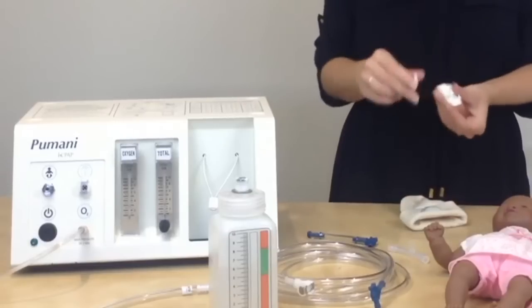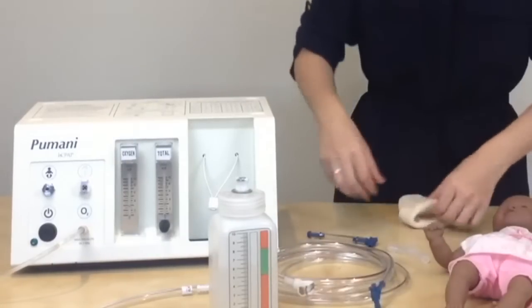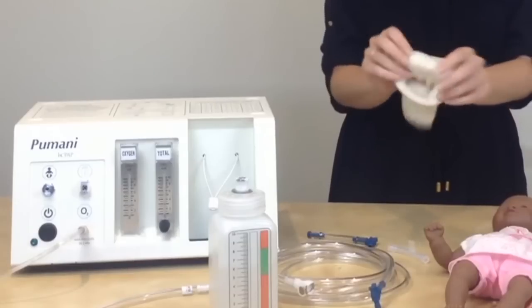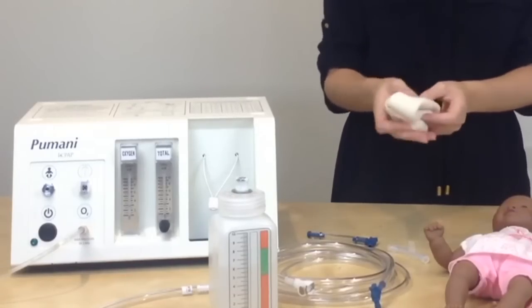The hat clips are designed to be reused, and you can clean and reuse them. The hats typically stretch out when they're on a baby, so you will need to throw out the hat and start with a new hat for each patient.